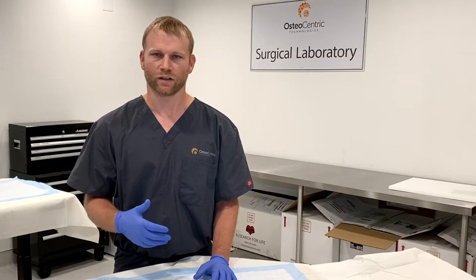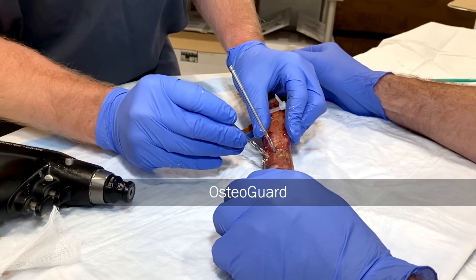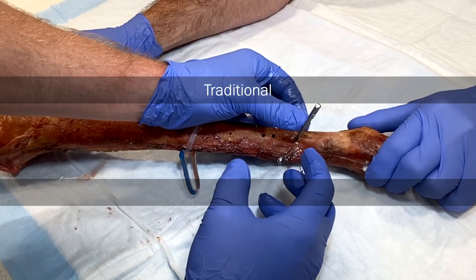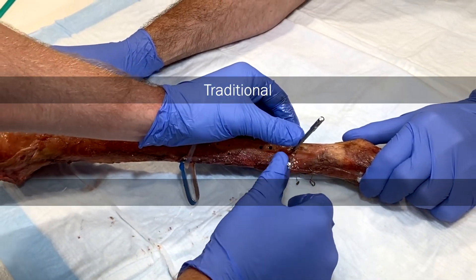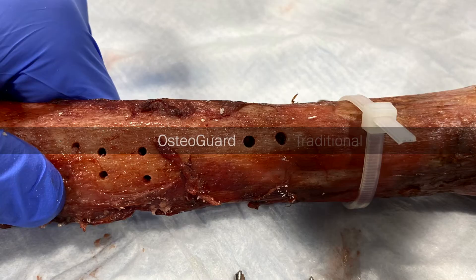And finally, I've noticed that the holes are more concentric, whereas some of the other drill bits, when you're drilling the far cortex, you can hollow out the near cortex of the cortical bone. Whereas with the Osteoguard it makes one solid pass through to the other side and you have a nice bone tunnel to place your screw at the end of your drilling process.